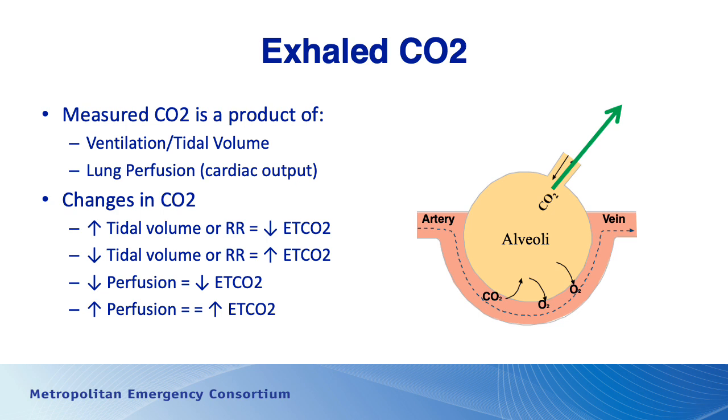And that's another example of where your patient's in cardiac arrest, then you provide appropriate interventions. The patient now has normal or return of pulse, return of spontaneous circulation, and your end tidal CO2 may go from less than 10 to 40 or 50. That's an example of where you increase perfusion to the lungs and you see an increase in the end tidal CO2.